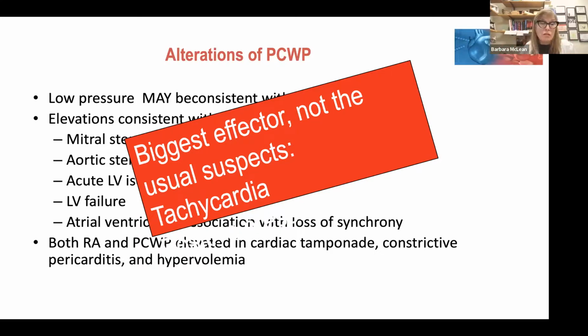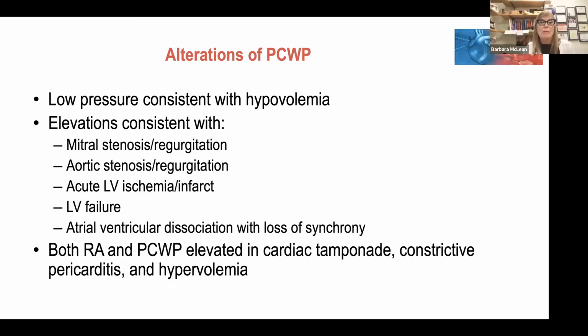You're downstairs in the ECC or in 12A or 5J or some other place. Your patient has positive pressure with a BiPAP, or they're intubated on a ventilator. CVP is going to be elevated. That's elevated because of the positive pressure, but it's not necessarily ventricular incompetence. So really, really, really important.